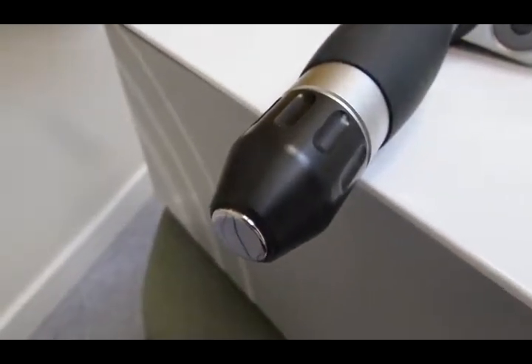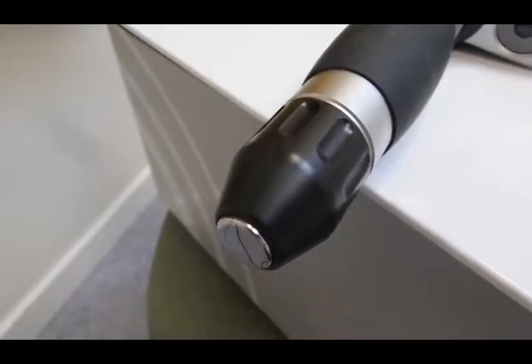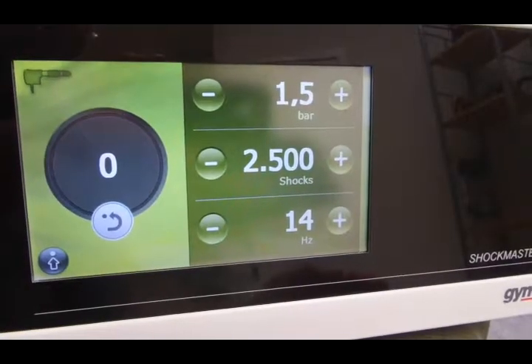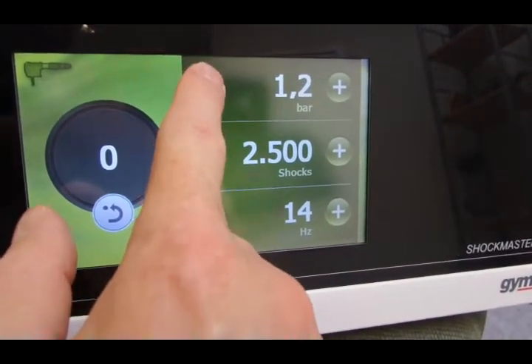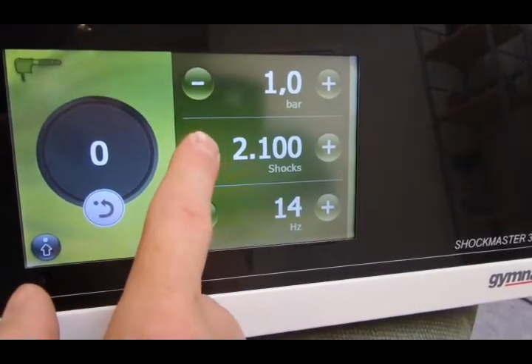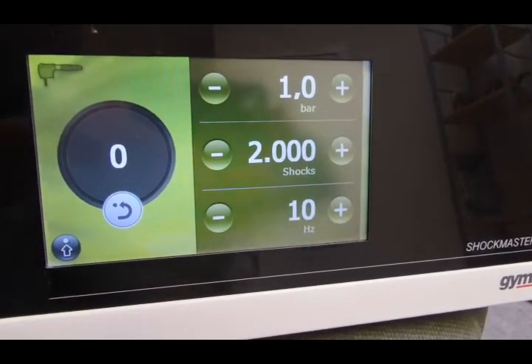We're back with treatment to the hand. We're using the 15mm convex head again. We're going to enter our settings into the machine just as we have done on the previous treatments. We need to bring the pressure down here to 1 bar, equivalent of 60 millijoules, coming down to 2,000 shocks and we're going to go at 10 hertz again.